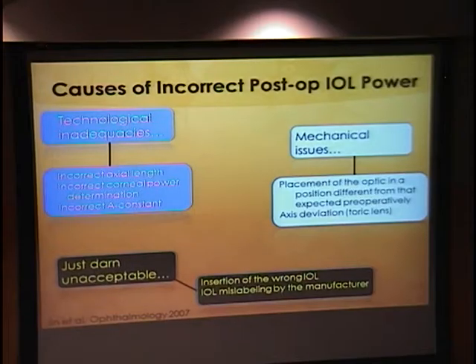Going into some of the reasons why lenses are explanted, you can group them into various categories. Some are due to technological inadequacies, such as incorrect axial length, incorrect corneal power determinations, and incorrect A constant. So it's just looking at the technology and the formulas used to determine the IOL power preoperatively and some of the assumptions made, as well as mechanical issues. When you put the lens in the bag, does it stay in, or does it go in the correct or presupposed position that it should go into? And then especially with toric lenses, you have to consider axis deviation. And then some reasons are just darn unacceptable: the fact that IOLs can be mislabeled by the manufacturer, or the wrong IOL might be inserted.